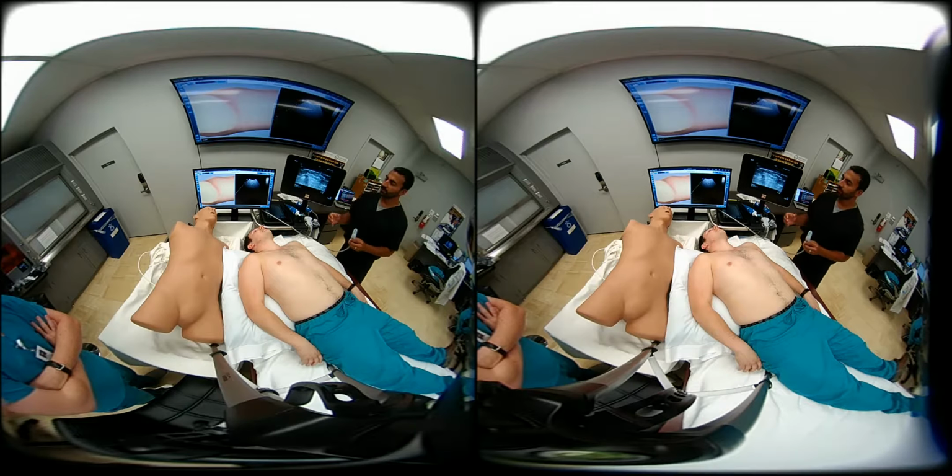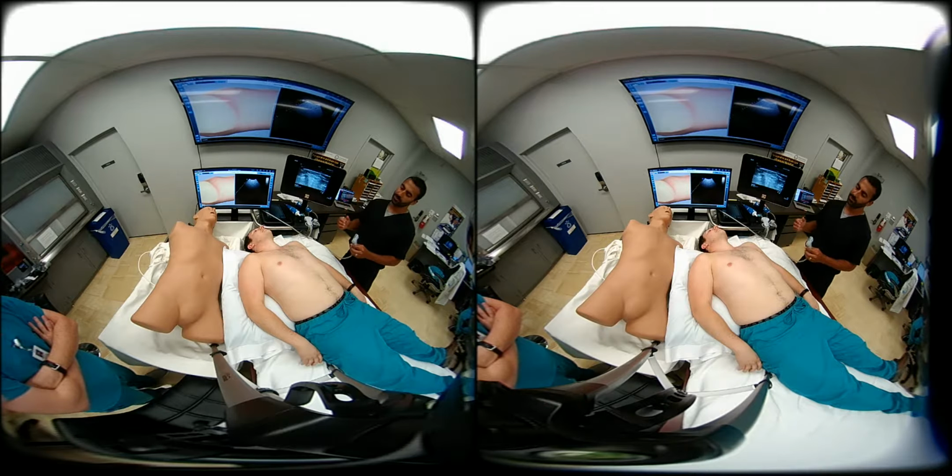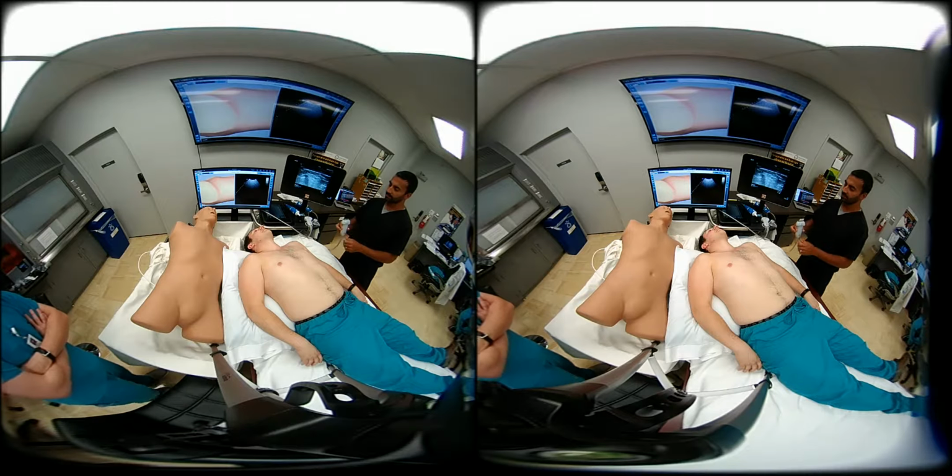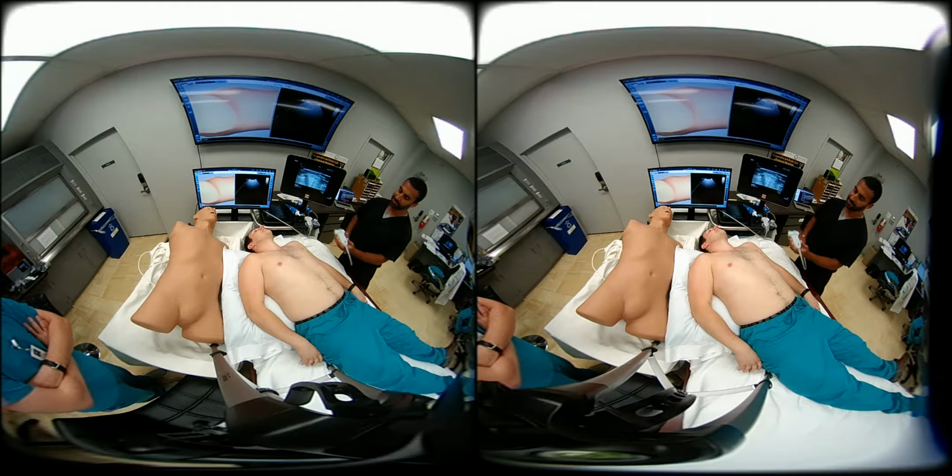We want to start off with a transverse approach because that will give us the easiest way of letting our probe rest on the neck and identify the trachea and evaluate for the presence of the esophagus, either lateral or just behind the trachea. Often we are able to visualize that with ultrasound.